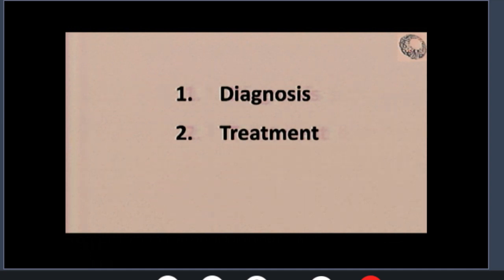Special order, and I implanted it folded in the first eye. In the second eye, it broke inside. So I had to remove half of it and implant the spare one that was 48 diopters. The difference between the eyes right now in refraction is very little, even if one eye has 52 and the other eye has 48, and the glaucoma is well controlled with only one drop.